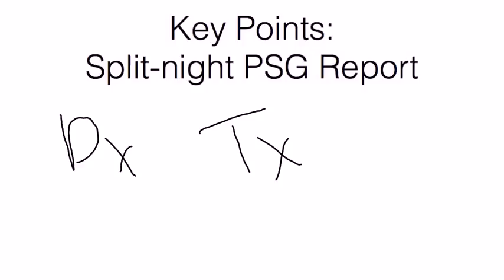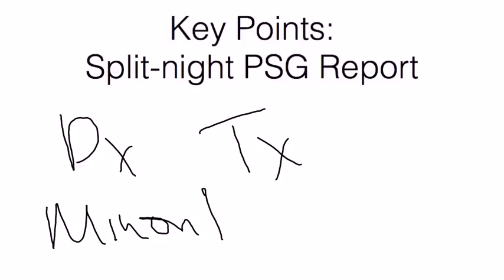Most labs nowadays should default to a split night for the realities of healthcare reimbursements and so on, to try to get as much done during one visit rather than have the patient come back for another night for the CPAP titration. Though there are a minority of patients that will require a full night sleep study, wherein the patient just sleeps throughout the night and there's no interventions taken.